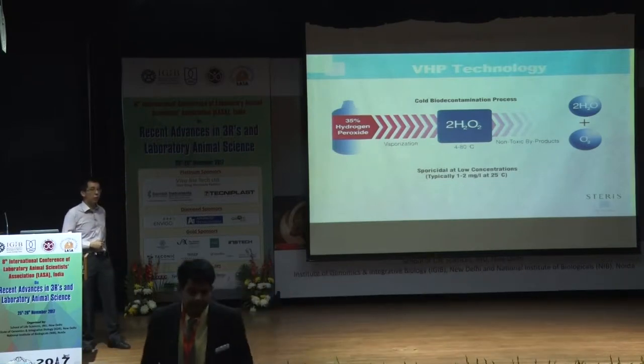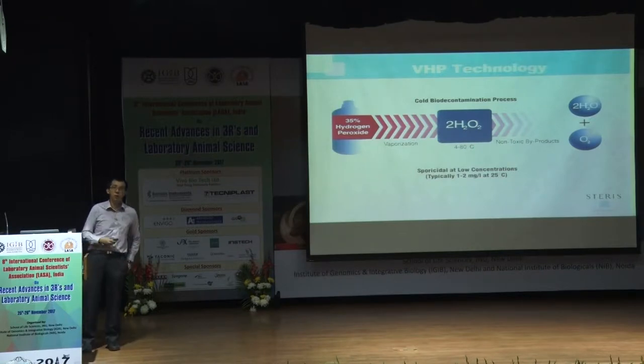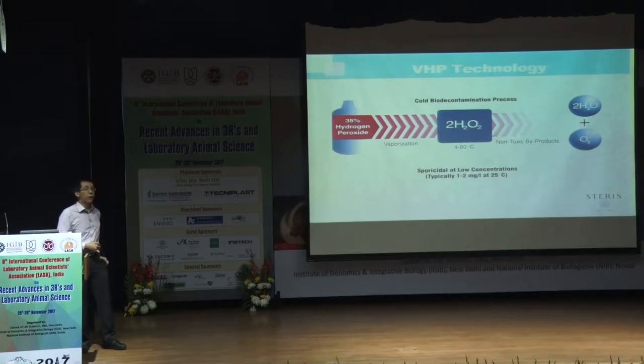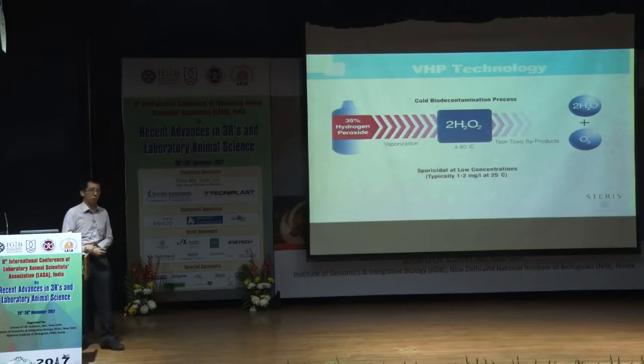Basically, we have the liquid hydrogen peroxide and we want to vaporize it. That means we apply heat to it so that it changes from a liquid to a gaseous state. It's in this gaseous state that it is most sporocidal, killing the widest range of microbes, which I'll talk about shortly, and it works at low concentration and low temperature. When hydrogen peroxide breaks down, it becomes water vapor and oxygen, both in the gaseous state, so there are no toxic residues.